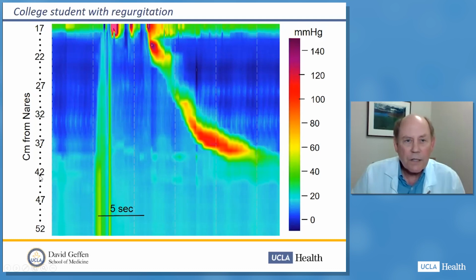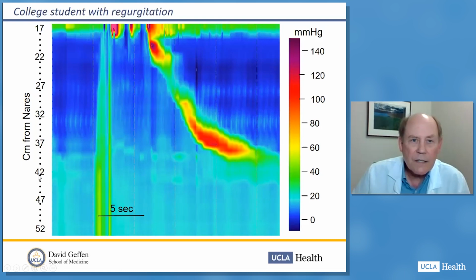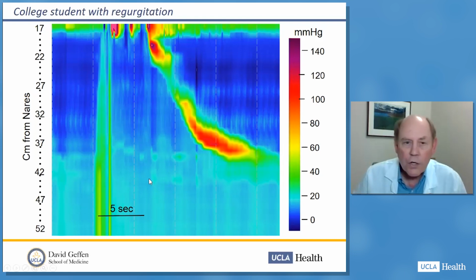We actually feed them something during the manometry, and then we have them wait in the manometry room with the catheter in place, and we give them 15 to 30 minutes after eating to see if this pattern occurs.